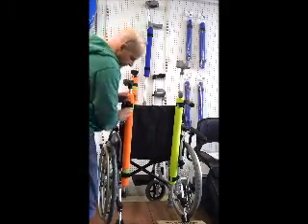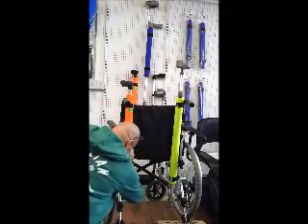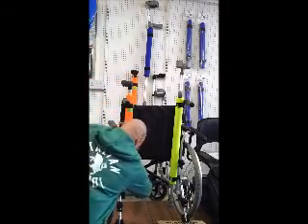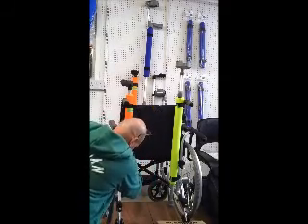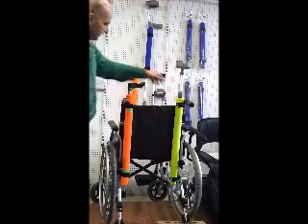Same again with the bottom one. This now gives you further stability. That is now attached to the back of a wheelchair.